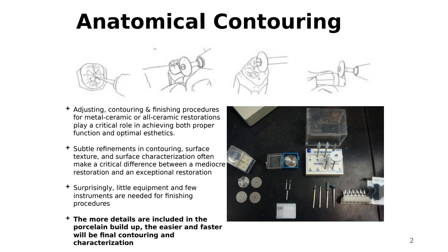So you can customize the kit that you work with, to make your life easier, and so you know that you can get good results with those instruments, those burrs. And like I said, always be friendly with your manufacturer representative, because they can tell you this is what's new on the market. Try it. This is especially true when zirconia came out.